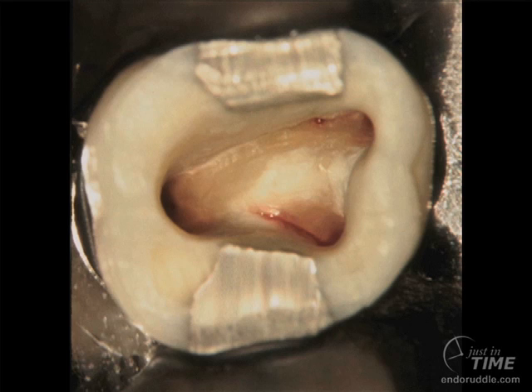And in one of those ideas, we talked about the red line test. In a vital case, blood will emanate from space. And if there's pulpal space that houses pulp tissue, then bleeding is normal. And we can use the bleeding as an indicator of where there is space to locate, so we can instrument this area, shape these canals, disinfect them, and fill them.